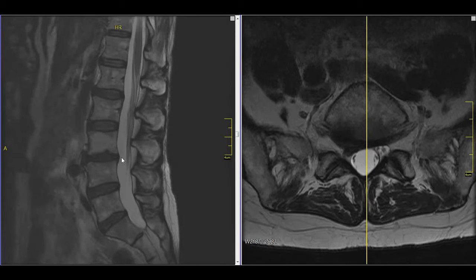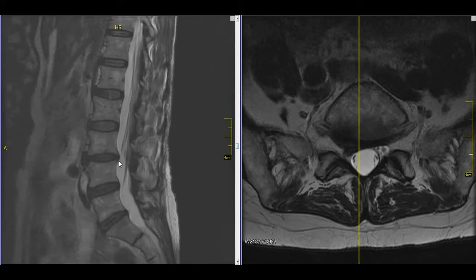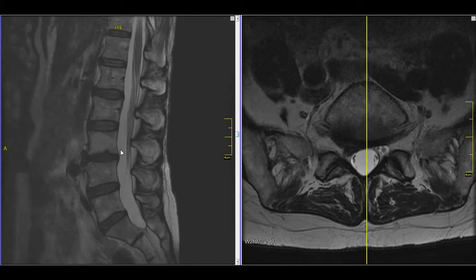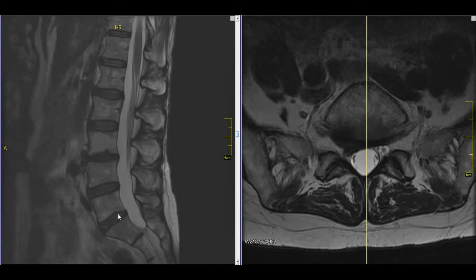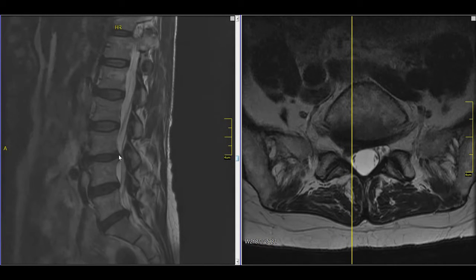Frequently MRI scans will have little things like this that I'm pointing to at the L3-4 level that look like they could be significant but actually are not. We'll see why that's the case in a moment. In this person, the problem is at the lowest level here, L5-S1, where about 45% of all disc herniations occur. As I scroll over to the side, we see a little bump on the back of the disc space — it doesn't look any more significant than that other one, but I'll show you in a moment why it is.